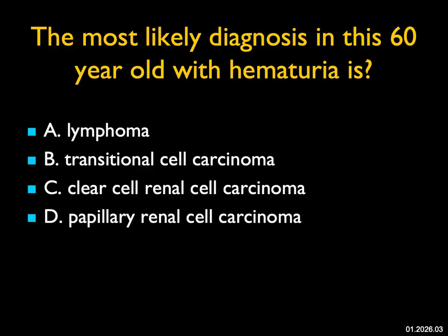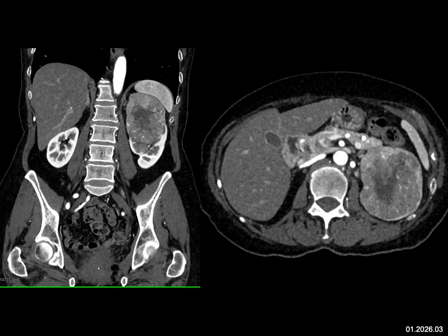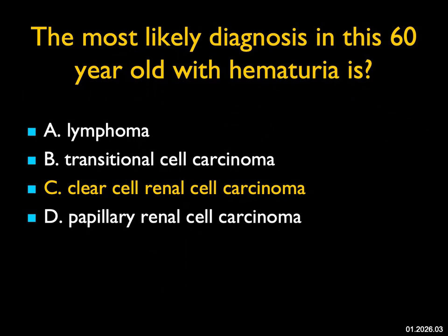The most likely diagnosis in this 60-year-old with hematuria: without even looking at the images, I have to think about renal cell carcinoma or bladder cancer. We see a large necrotic tumor that's somewhat vascular, with extension near the hilum of the kidney. On the coronal view it's an exophytic mass, not the adrenal, pushing against the spleen. Lymphoma can present with large solid masses but usually not so vascular. Transitional cell is more infiltrative. Papillary renal cells are typically hypovascular. Clear cells make up 80–85% of renal cell carcinomas — the classic vascular mass with central necrosis is clear cell renal cell carcinoma, which is the correct answer.